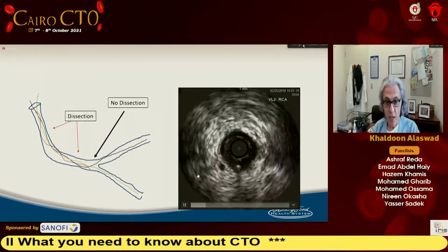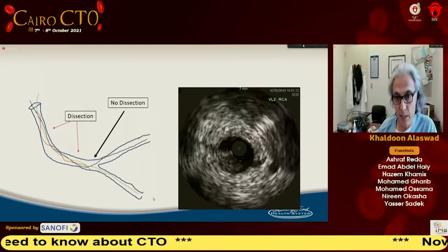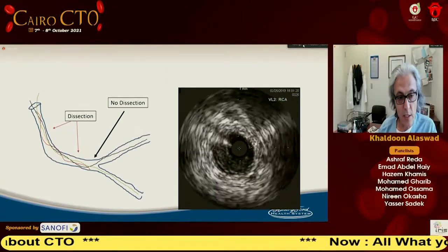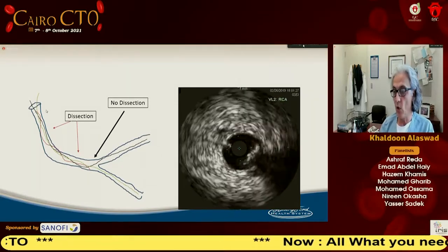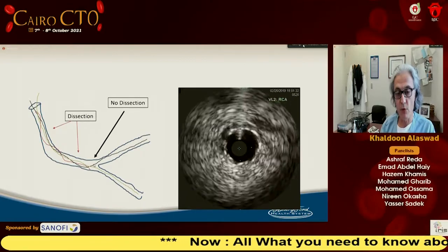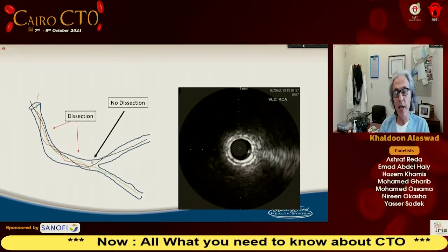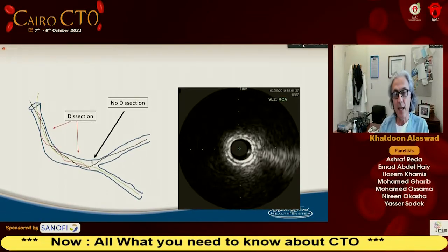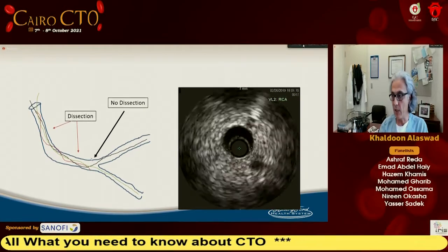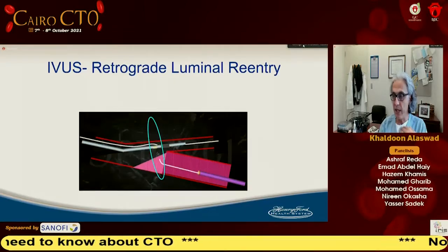Like, this is for Fredo Galassi's talk. If you notice, we are basically doing the IVUS from the PDA. I noticed that we have a dissection all the way in the RCA, but there is a small landing zone right before. So to my surprise, the wire entered right before the bifurcation. I wasn't planning on stenting it, and now I stented the RCA up to that bifurcation, and the only way to get that information is by IVUS.